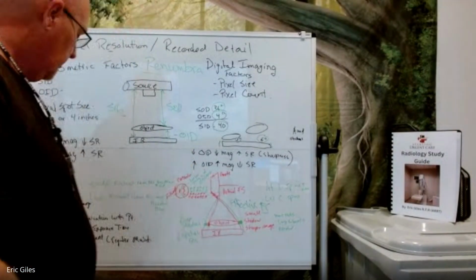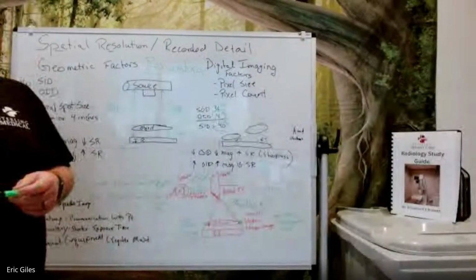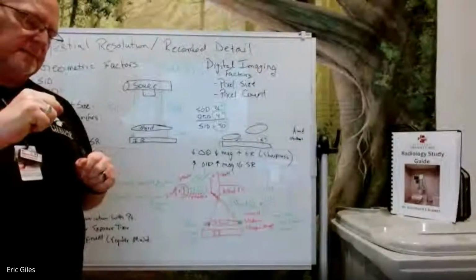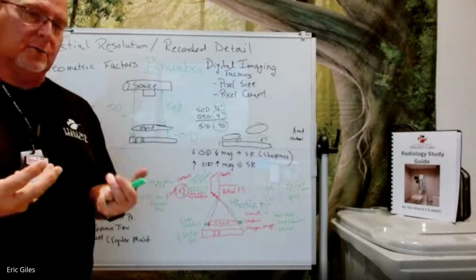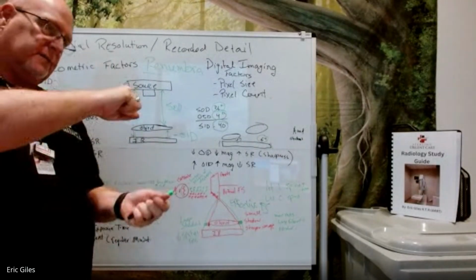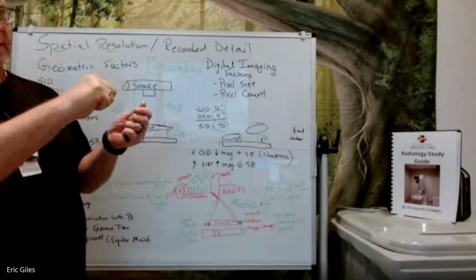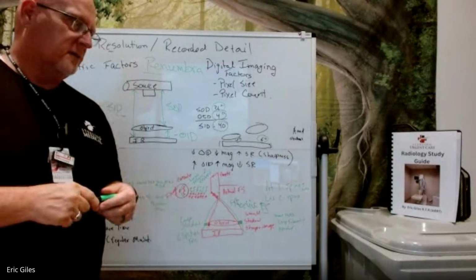The third one is mechanical or equipment. I've seen a couple X-ray machines that, their locks get all hanky. They stop working, right? So if you put your X-ray tube in an upright position and then it starts to fall, at that point you know you need to get some work done on it.